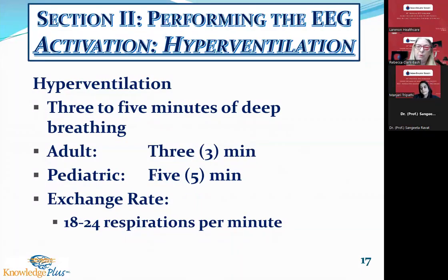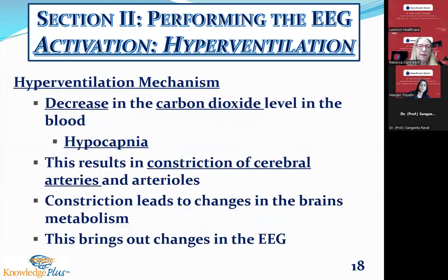It's the same point I've made through this slide. It is really important when behavior, attention, academic performance, when those three features come up in a history, it's important to do not only the 5-minute HV at the beginning of the test, but also after you've tried to get them to sleep, have them HV again. And you can make it really fun playing the game. We're racing, I'm winning, yet she's sitting there on the bed with her eyes closed.